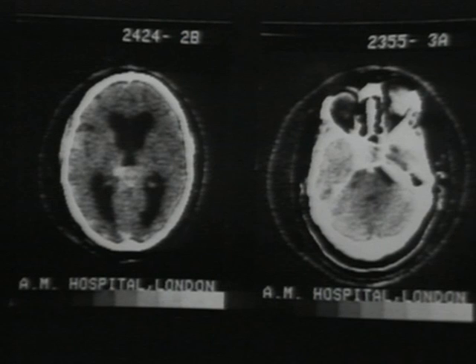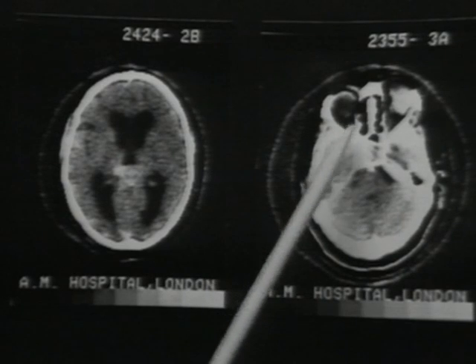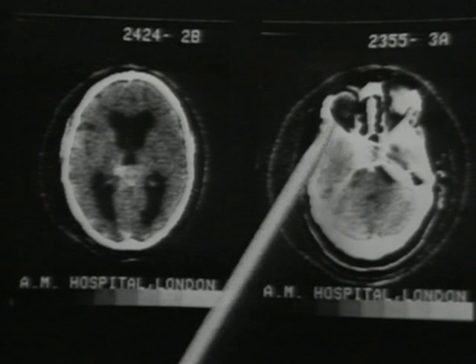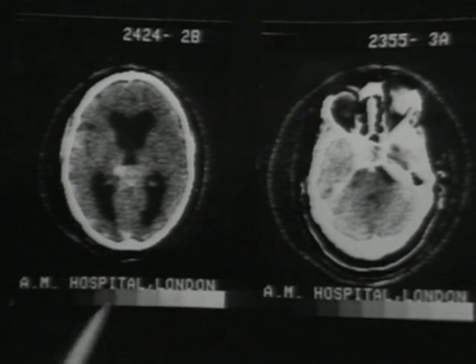Now, lastly, with some slight modification of technique, the contents of the orbit may be examined. The optic nerve is surrounded in the muscle cone by fatty tissue, and as this has negative absorption values on the scale used, any alteration of density due to abnormal tissue may be easily identified. Here we have a patient with a tumor which is causing proptosis of the right eye. If you cast your eyes on the left side, you can see the globe of the eye, you can see the optic nerve, you can see the thin strap of the lateral rectus muscle, and the unbroken low density of the fatty tissue within the muscle cone.